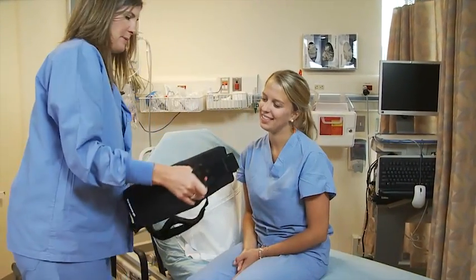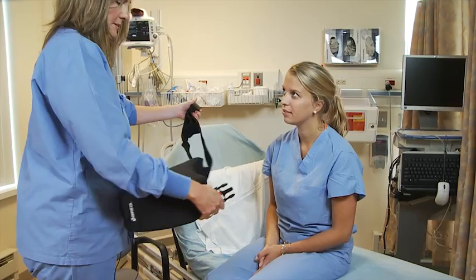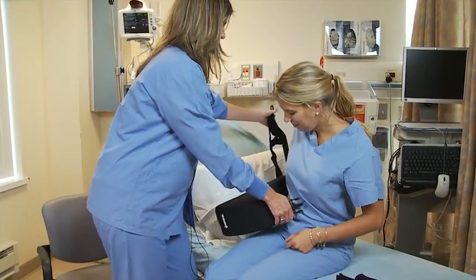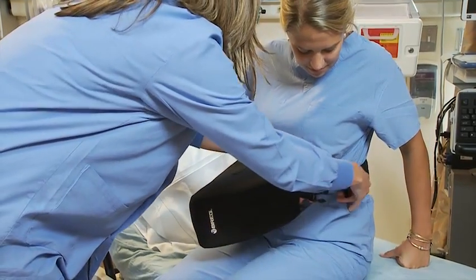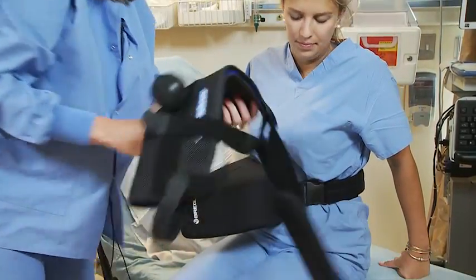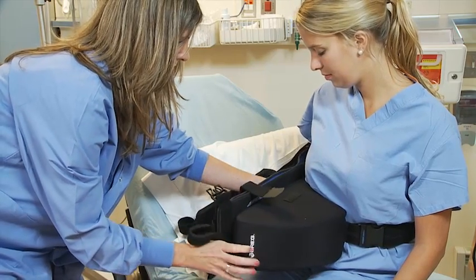There's another style pillow that you may also be going home with. This is typically seen for patients going home who've had labral repairs. So this is the pillow — first we're going to start by fitting you with that. This part here is going to go right up against your waistline, come around like a corset and snap right in place. Now we're going to take the sling and line this velcro strip up right over here with this velcro strip so they match.